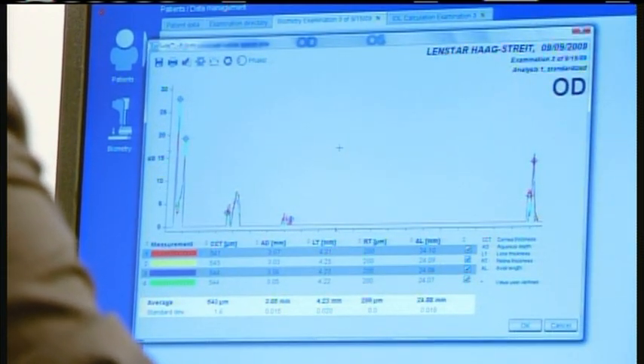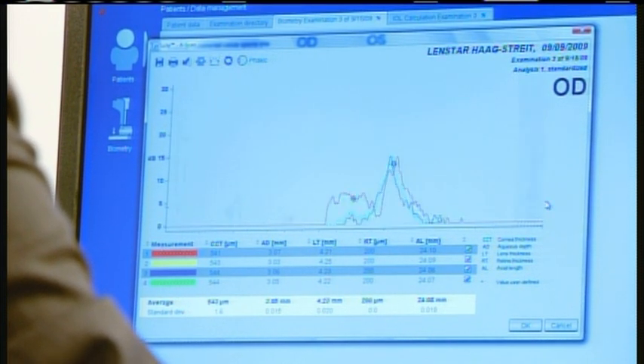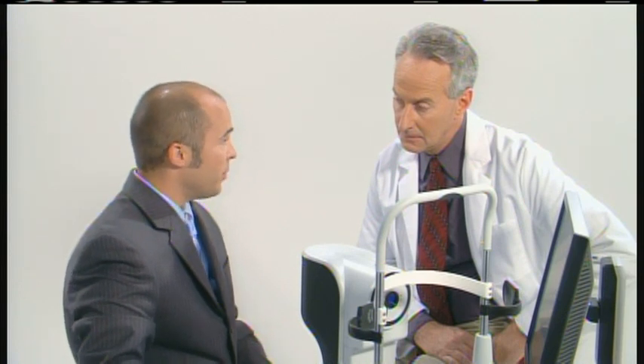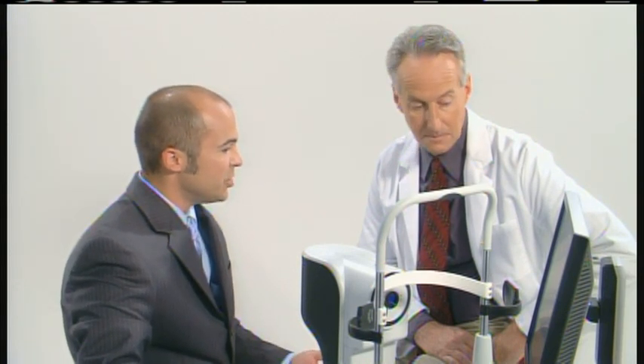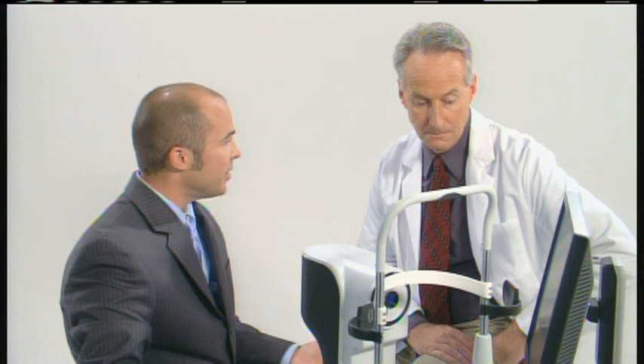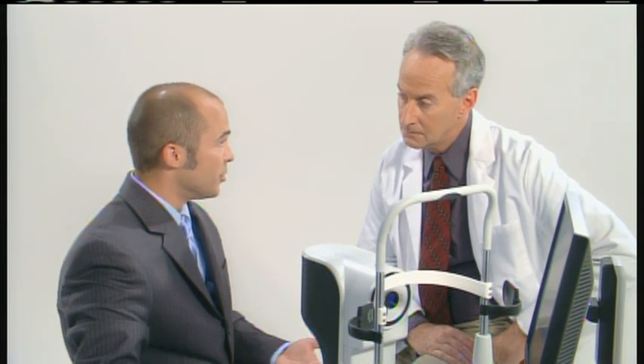We can look at retinal thickness again — it always opens to the same screen from this first setting. We can zoom on the retina here, and we can see that we have the internal limiting membrane and the RPE here as well. What's good about this is if you have a patient that comes in, say, one week post-op and they're complaining that their vision just isn't as clear as they would like it to be, you can look back at this, calculate the retinal thickness, repeat the scan again, and see if the retinal thickness has changed. If it's gotten any thicker, then you can go ahead and assume there's probably some macular edema and treat early rather than later, and the patient will get better results.